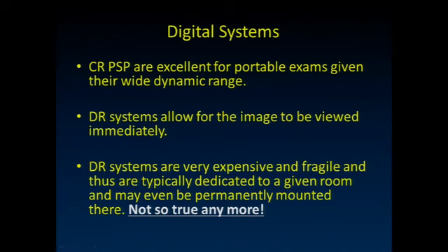DR systems, well, cesium iodide, that's a very delicate crystal, but now if you go to some of these photoconductor materials like amorphous selenium, they're not as delicate, and so you can make a portable plate to go with. And now with wireless technology, you can make a digital plate, right?